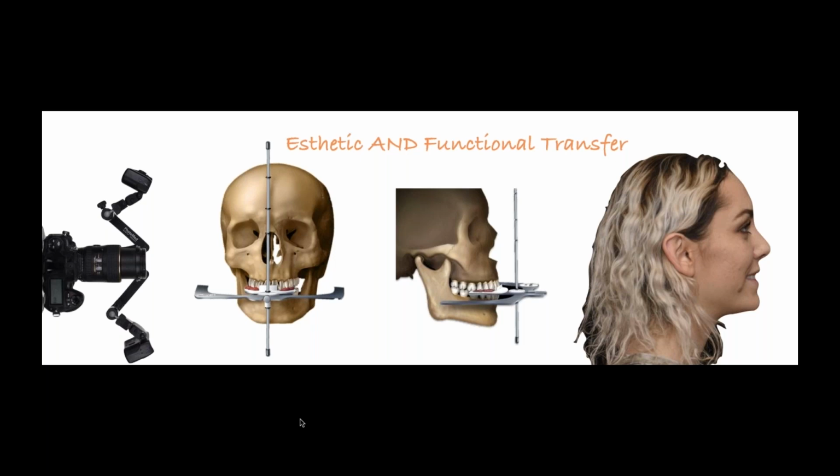And if we try to put perfect teeth in her face, my argument here is that when we're waxing teeth or taking a mold of teeth out of a digital environment, and just putting them into the face and thinking they all work because they're symmetrical when the face is not, is challenging. The example I've used a thousand times is the same example. How many times do you see a denture in a patient's face and not say, that's a denture? You almost always know it's a denture. Why? Because you're taking a mold of teeth and putting it into a face that is not symmetrical. And that's where the challenge comes in.